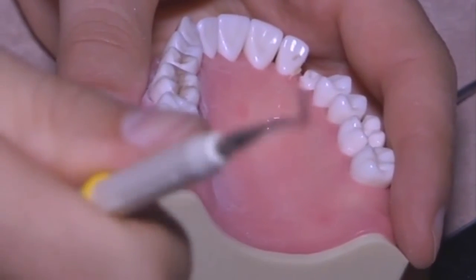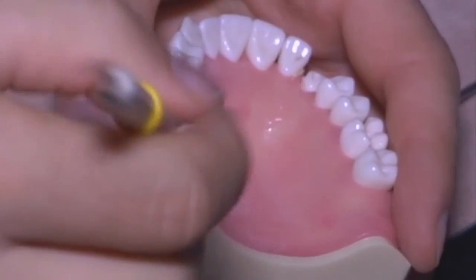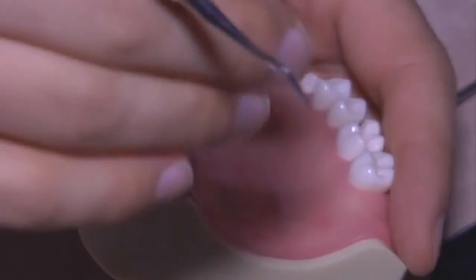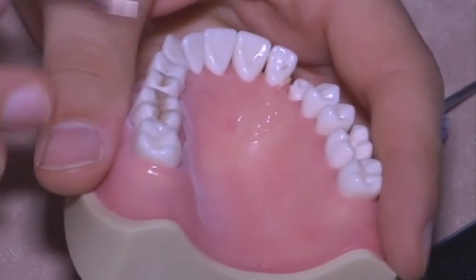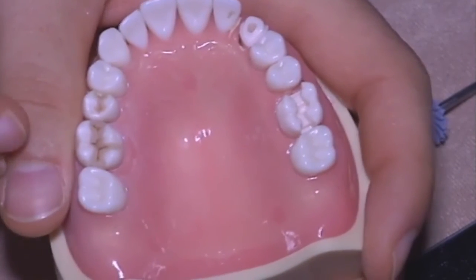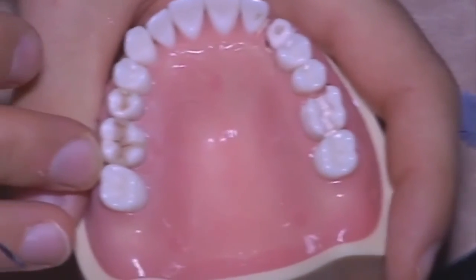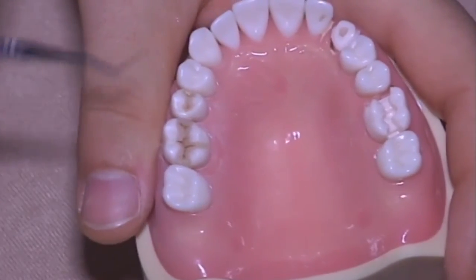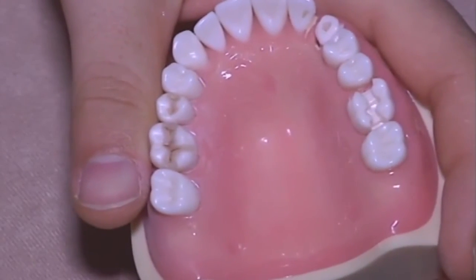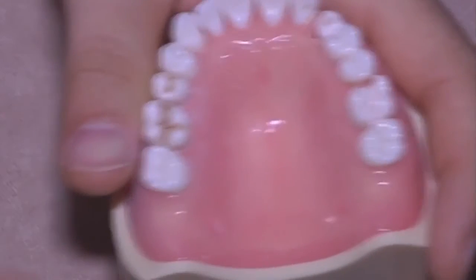correction after occlusal control. And this is the step I hate above all, because after this, in reality, 1 hour has passed, you are working for 1 hour on the same teeth, and once you finish, you just want to push that patient away from your office. You are awful at that.